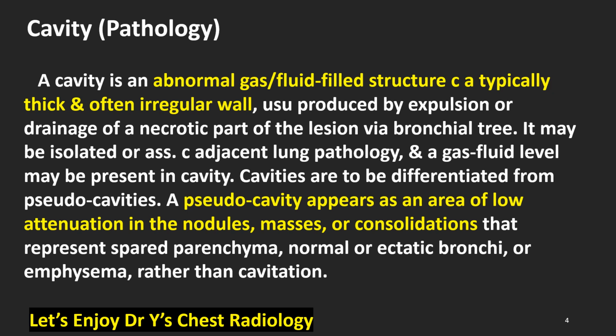A pseudocavity appears as an area of low attenuation in nodules, masses, or consolidations that represents spared parenchyma, normal or ectatic bronchi, or emphysema rather than cavitation.